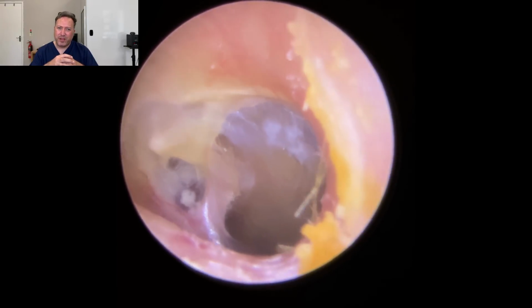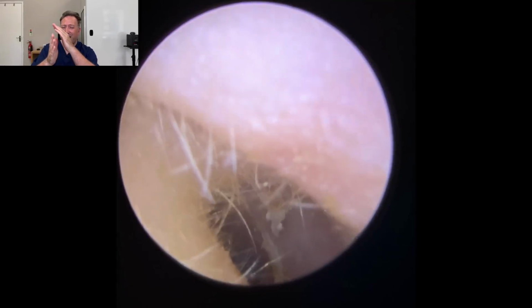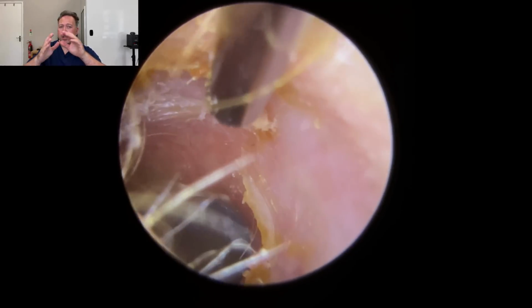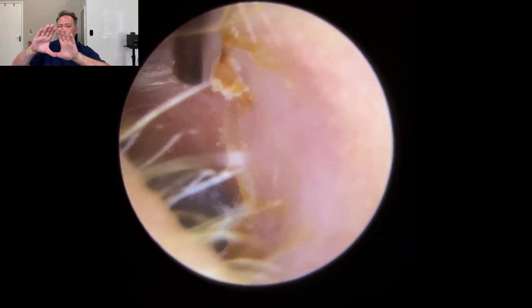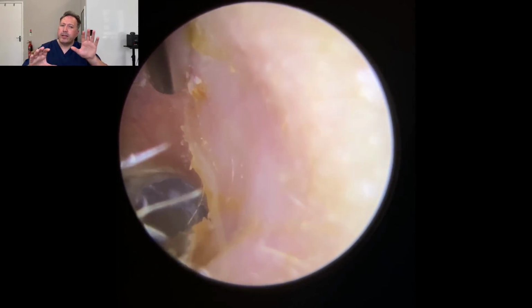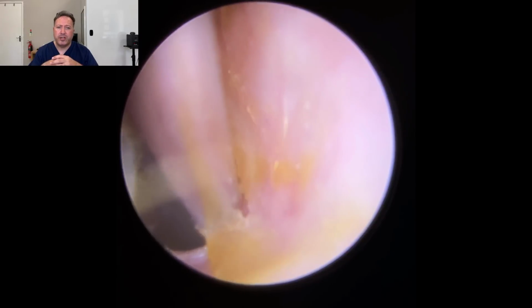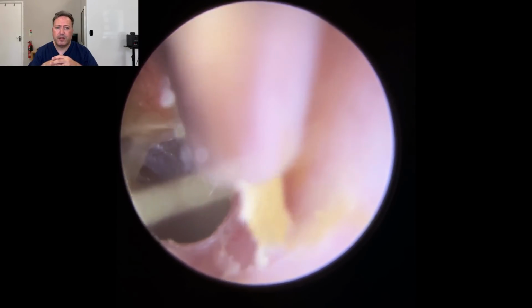You see the eardrum there as well. Looks a bit retracted. You can see the hammer bone there quite prominently. And you've got that section to the right-hand side of the eardrum, which has a little bit more flexibility to it, has actually been drawn in just a little bit more. We'll take another look at that eardrum now so you can get a good look at it.